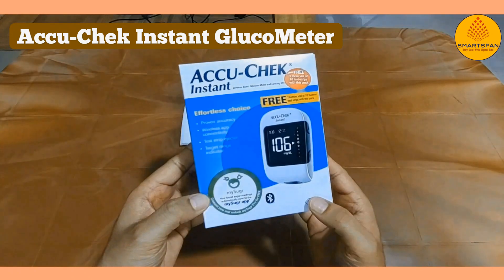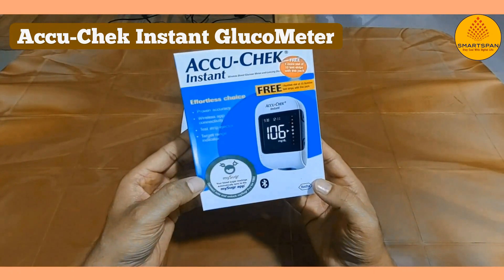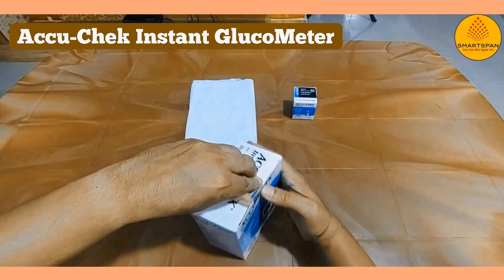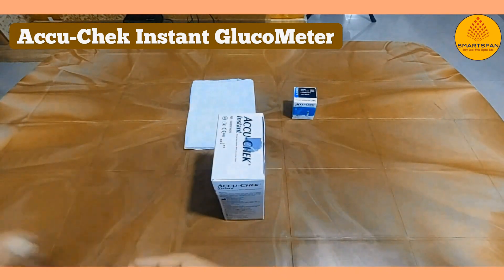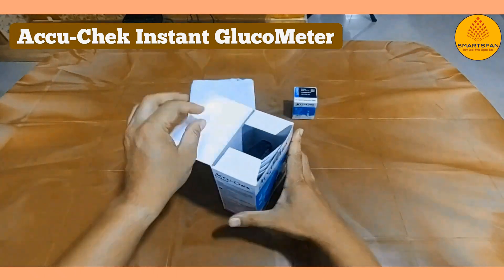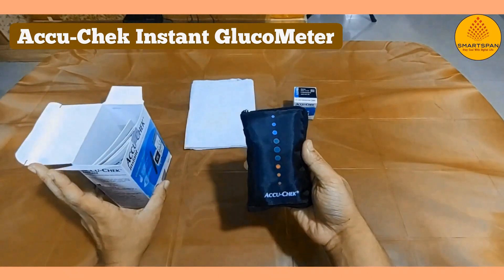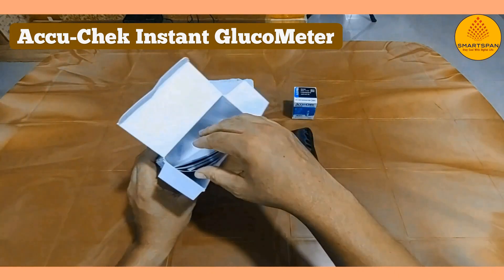Welcome to our video guide on using the AccuCheck Instant Glucometer, a reliable tool for monitoring your blood glucose levels at home. Whether you're managing diabetes or just keeping track of your health, the AccuCheck Instant Glucometer is designed to make the process quick and convenient. In this video, we'll walk you through the basics, from preparing the device to reading your results.